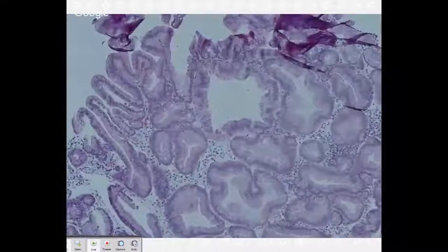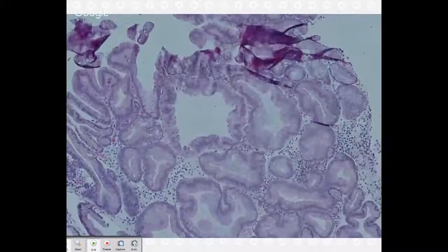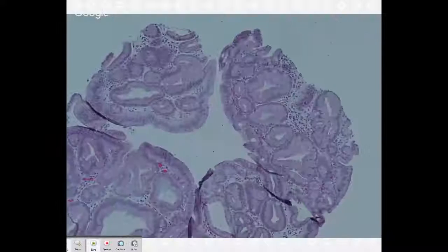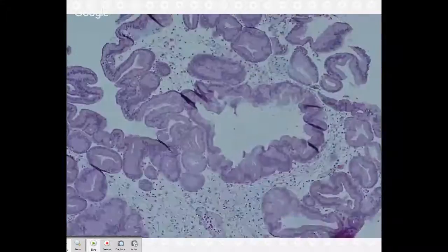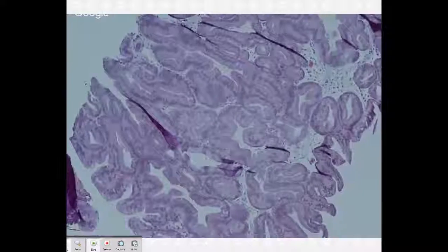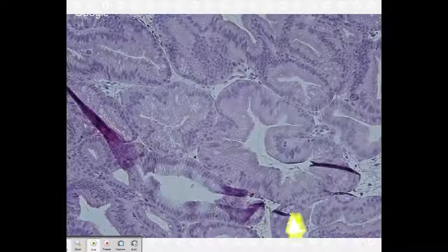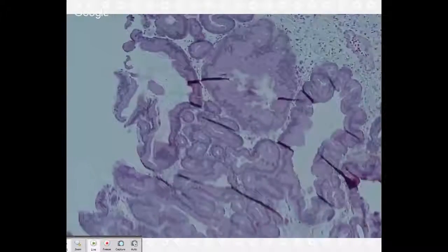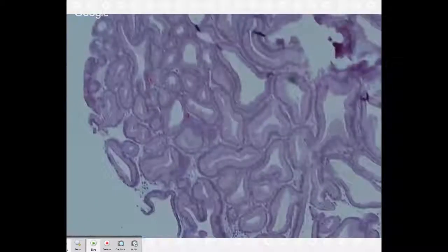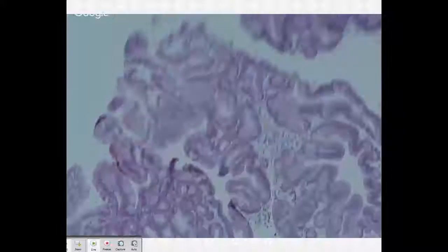If you start to get one that looks a little, let me see if I can find a good spot. This one is pretty much low-grade dysplasia, despite the back-to-back architecture. When they do become dysplastic, the nuclei actually get bigger, rounder. They start to lose their prominent cytoplasm. The architecture can get more complex. And so those need to be completely excised. Regardless, pyloric gland adenomas probably should be completely excised because they can have high-grade dysplasia and progress to an invasive carcinoma.